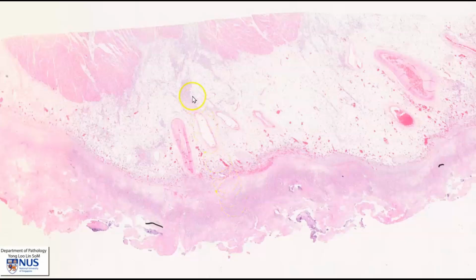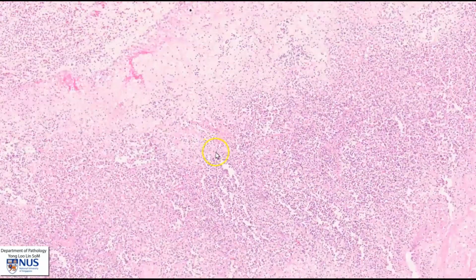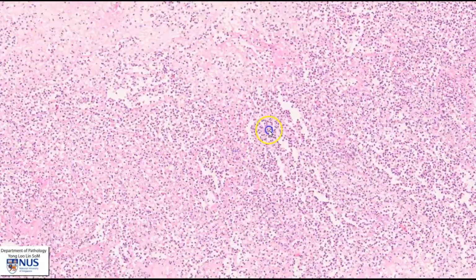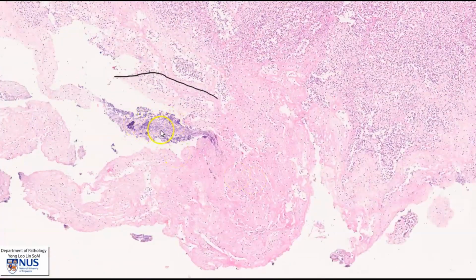In summary, here is a virtual microscopy slide of purulent or infective pericarditis, where we can see this thick layer of pus or purulent exudates overlying the visceral pericardium, composed of numerous neutrophils or acute inflammatory cells admixed with strands of fibrin as well as necrotic cellular debris. And the cause of this is usually bacterial, and the treatment is drainage with systemic antibiotics.